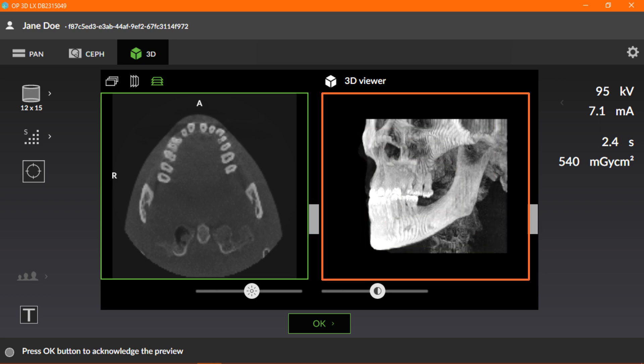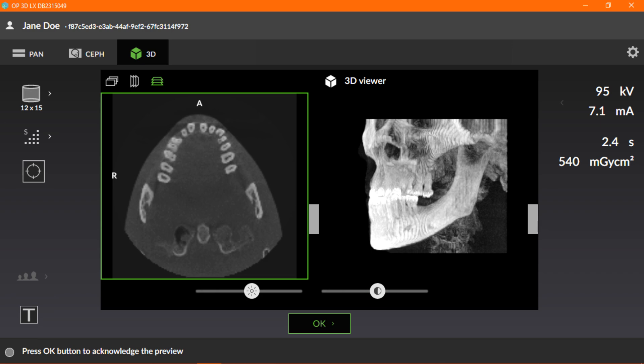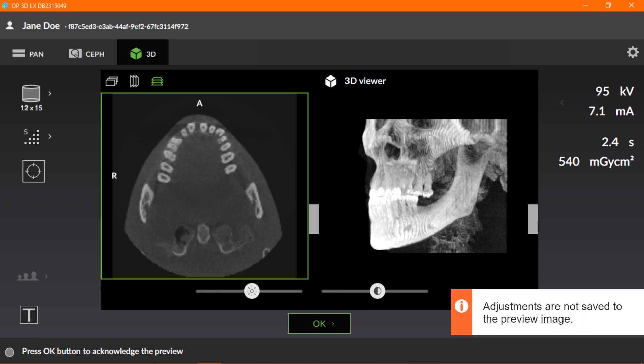In the rendered volume view on the right, you can rotate the preview using the slider on the right side of the image. You can adjust the brightness of the shown image preview using the brightness slider, and you can adjust the contrast of the shown image preview using the contrast slider. Finally, it's important to note that any adjustments made in the Quick Compose are not saved to the preview image.